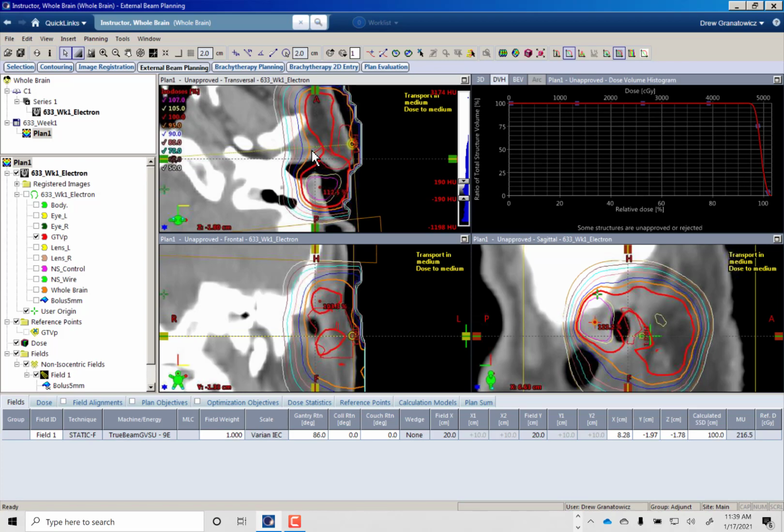So if we are treating a perfectly flat surface made of water, that's great, that's fine, because our dose distribution will be flat, and putting 100% there will be basically the same as putting 100% at Dmax, which is usually what you're trying to do. In this case, though, we have all these other things going on. It's shifting the dose quite a bit. So we have this big hot spot here, and 100% is not at Dmax, or not where we would expect Dmax to be.